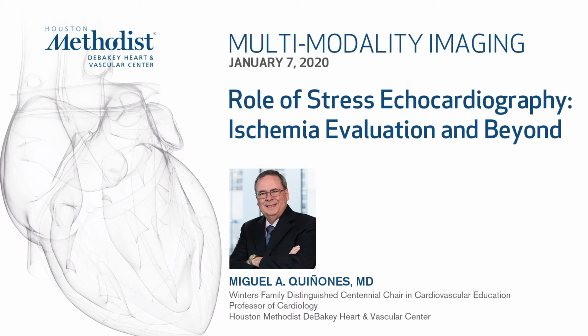So today we're going to talk about the role of stress echo. By now, we've had sessions on left ventricular function, global, regional. So this is basically applying these concepts, but using a stress modality to look for changes of heart function with stress, most commonly caused by ischemia.